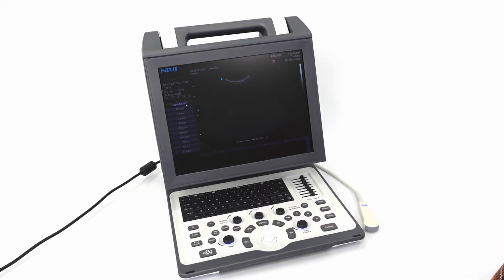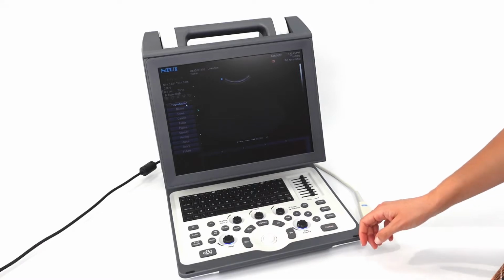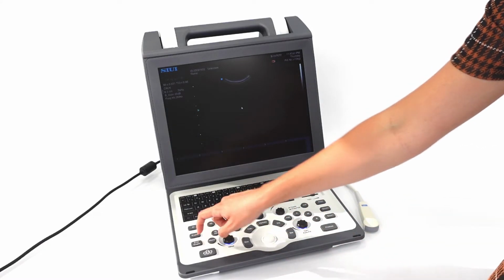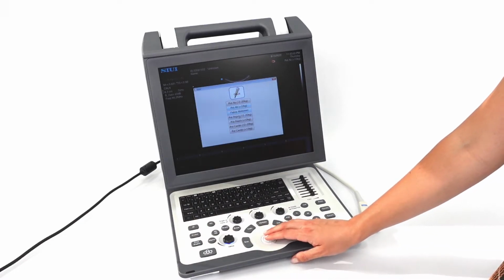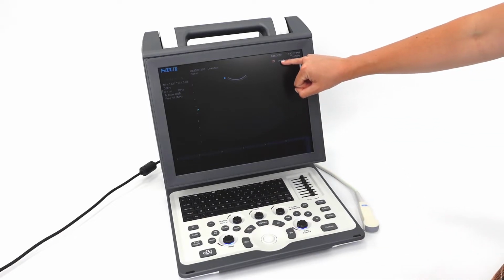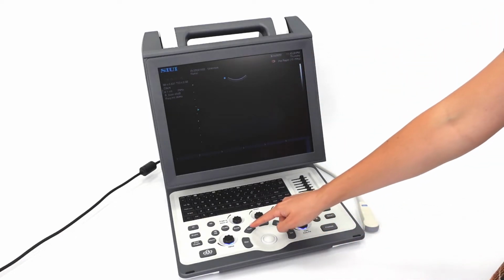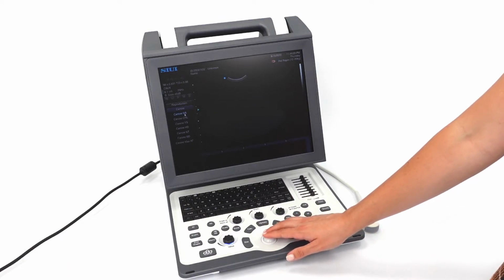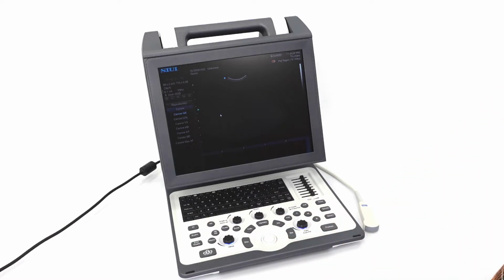However, if you know from the start you're going to be scanning a dog for pregnancy, then the best thing to do is just before you even start your exam, click Exam and make sure you're in Pet Repro. If you're in the Repro mode, then automatically when you press Calc, you're already going to be presented with the various canine gestational age calculation packages.